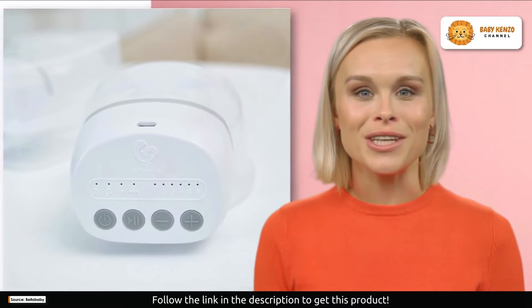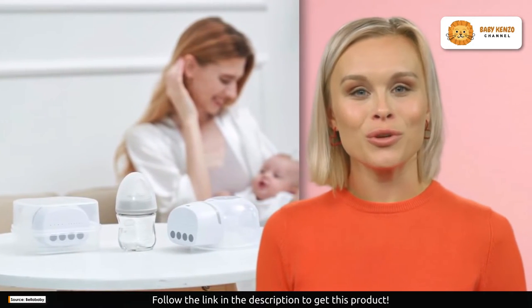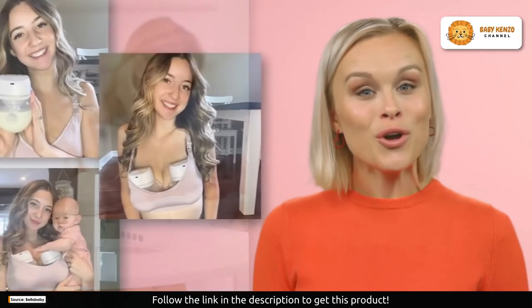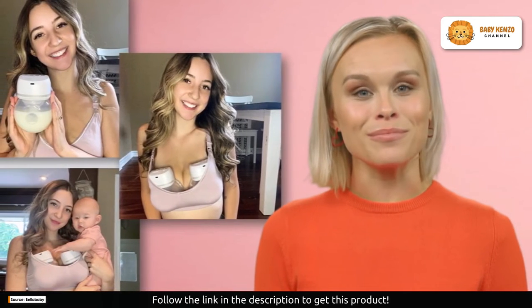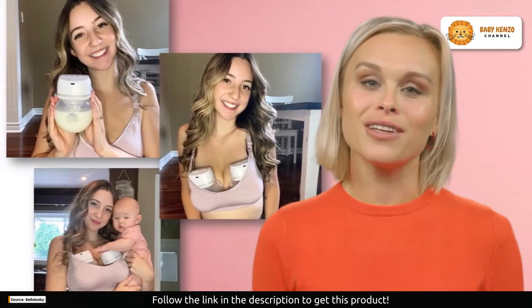Plus, customization is key when it comes to breastfeeding, and the Bellababy W42 knows it. With four modes and six levels of suction, you have complete control over your pumping experience. Find the settings that work best for you, ensuring comfort and efficiency every time.